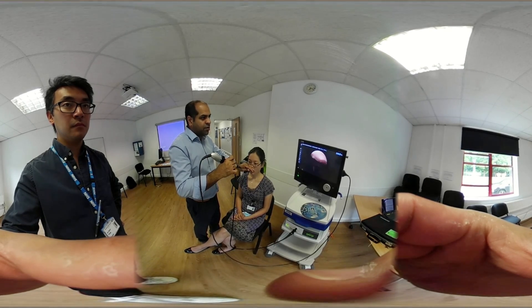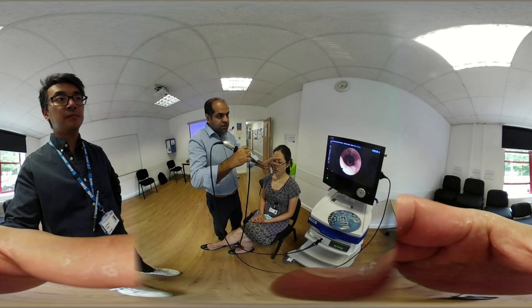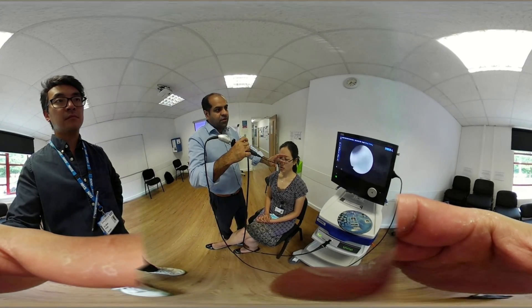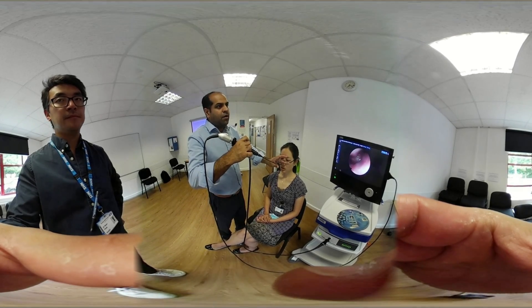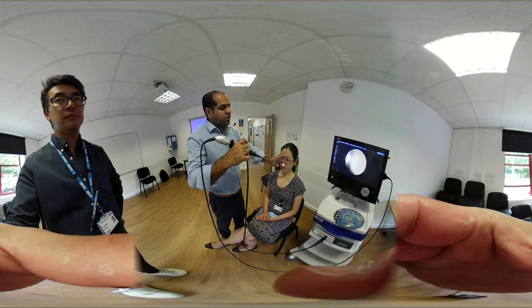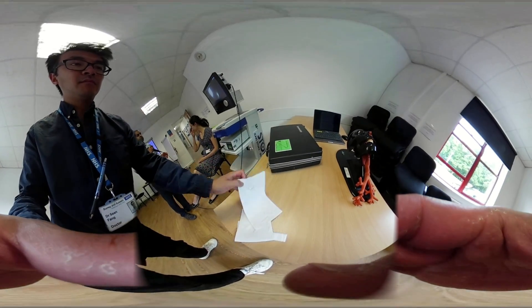When coming out, we have to be careful — control it with our finger, making sure we're not touching the back walls. As we come to the patient's nasal space, we change position, and there may be a bit of mucus on the end as you come out. Gently come out of the nose, supporting the entire way through, and we're out.